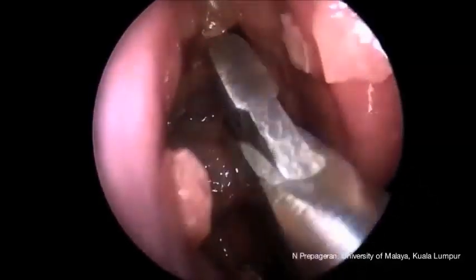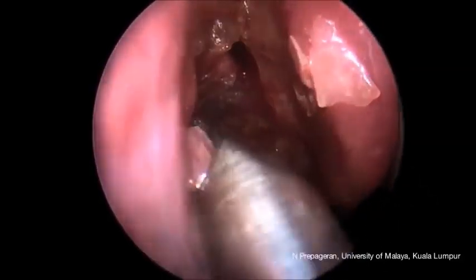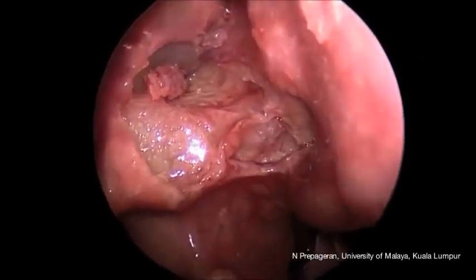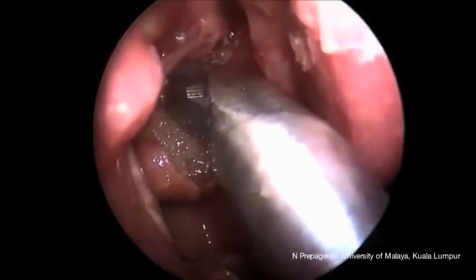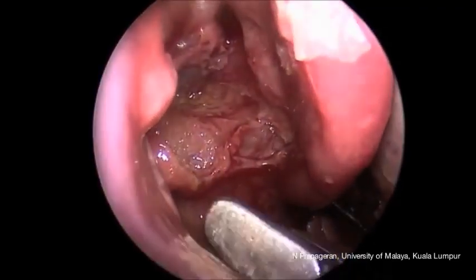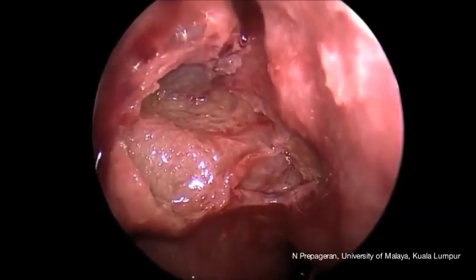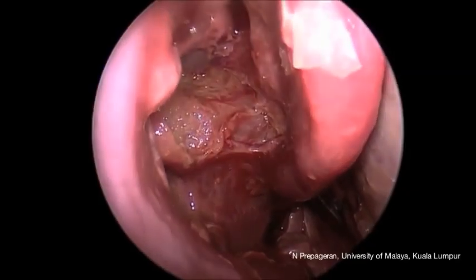Let me remove the upper part of the bulla as well, so that there's a complete excision of the bulla ethmoidalis, or the anterior ethmoids. This shows us very nicely the ground lamella, and again you can make out how the middle turbinate turns inside to form the ground lamella, which is divided into the vertical and the horizontal portion.